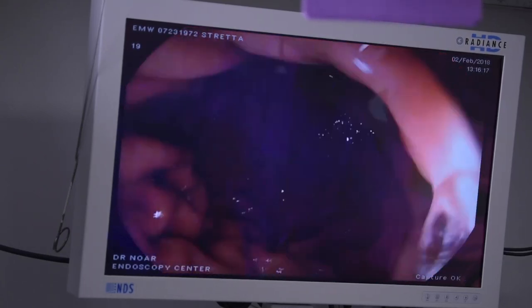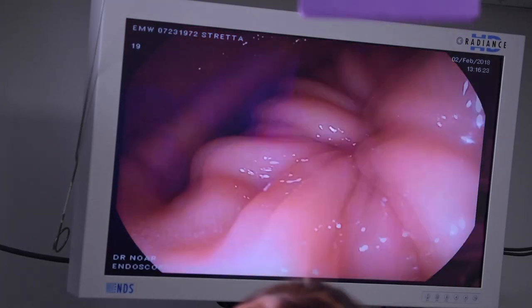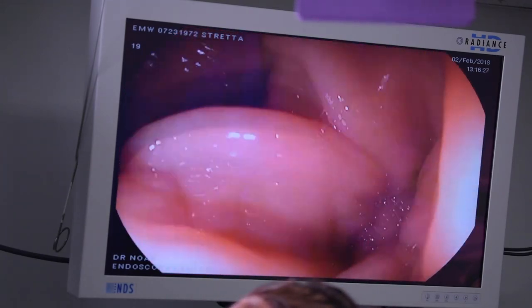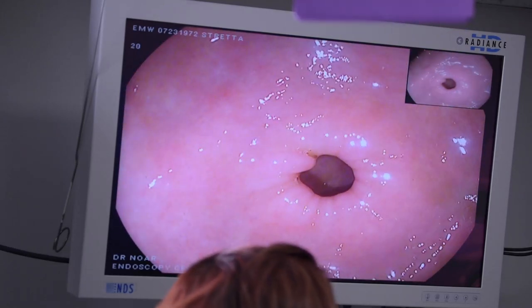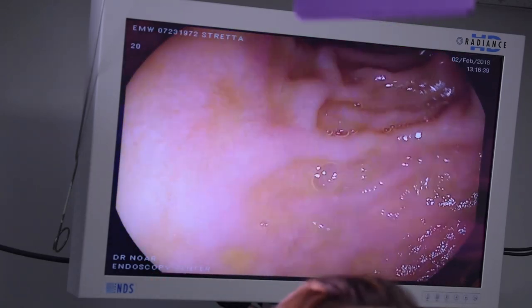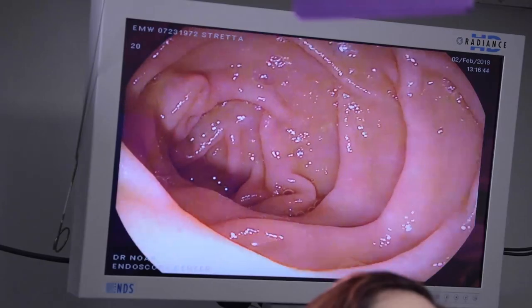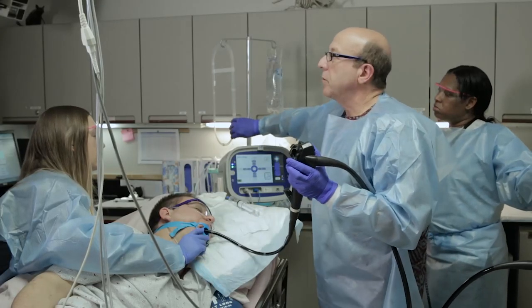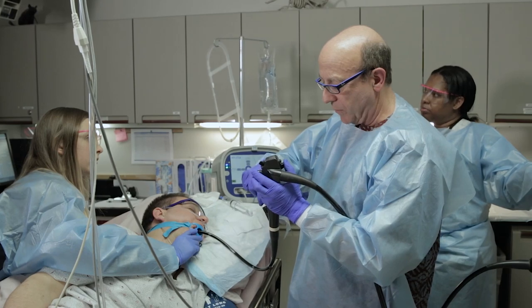We're going to look at the bottom of his stomach to make sure we don't have any contraindications such as gastric ulceration or cancer — there is nothing abnormal here. This is his pyloric sphincter muscle, which opens nicely, and we'll go through into the intestine. This is the duodenum — first, second, and third portions — all normal. At this point we need to place our guidewire, which is going to go down into the intestinal tract into the duodenum through the endoscope, and this will be the guide that we use.